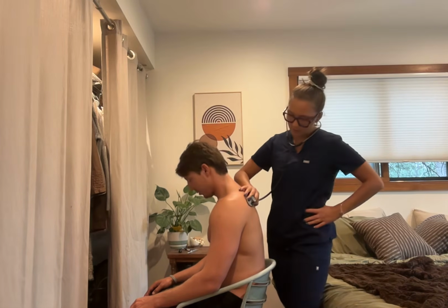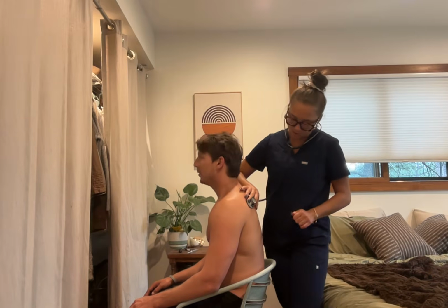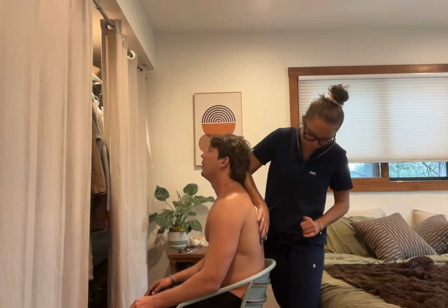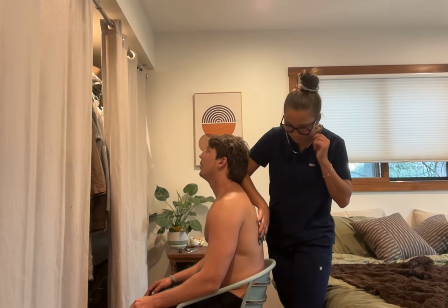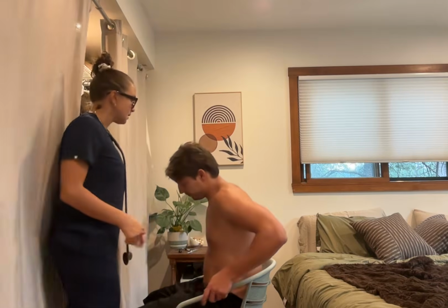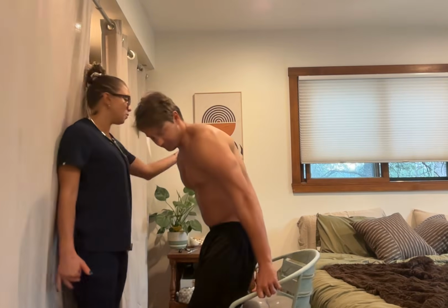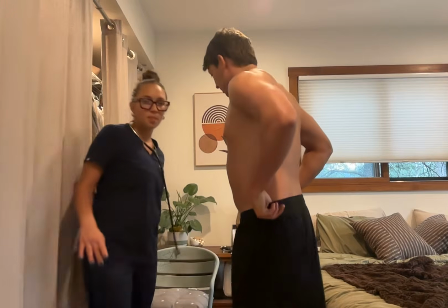And then moving 8 points on the other side. For the purpose of timing for this exam, I will just continue with 2. Good. Lung sounds are clear. No adventitious breath sounds. Now I'm going to have you stand up before you move into the bed for the abdominal exam. Have you used the restroom? I'm good to go. Okay.